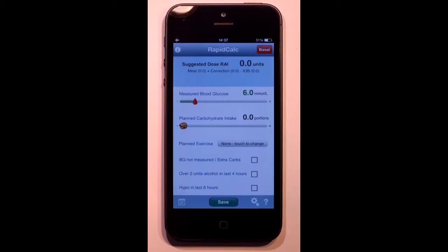Welcome to RapidCalc, the dose calculator for diabetics. It's designed to remember things so that you don't have to. It makes dosing as simple as 1, 2, 3.